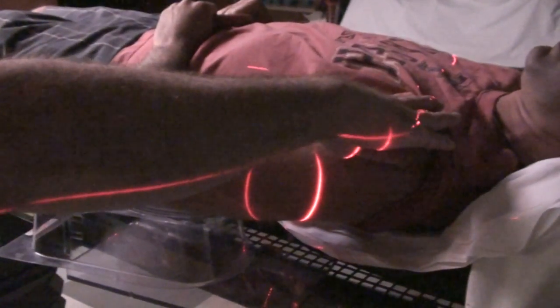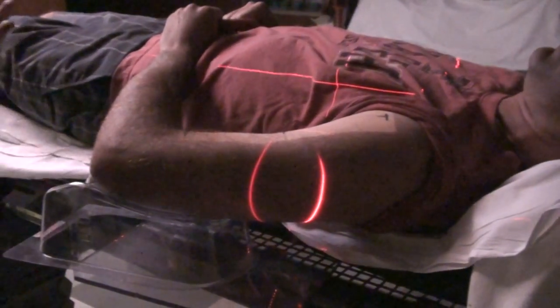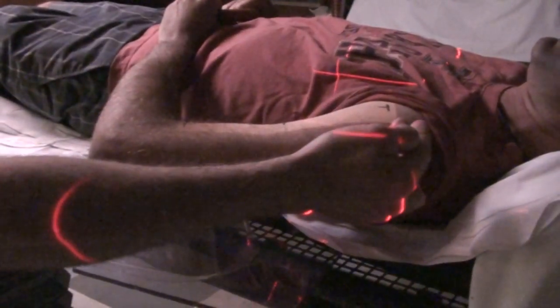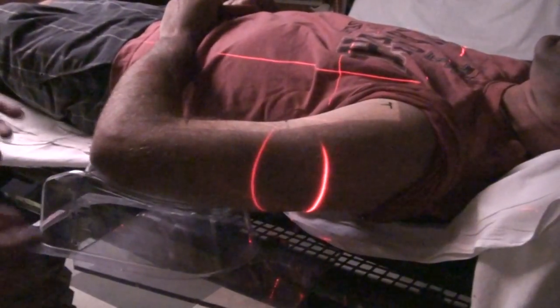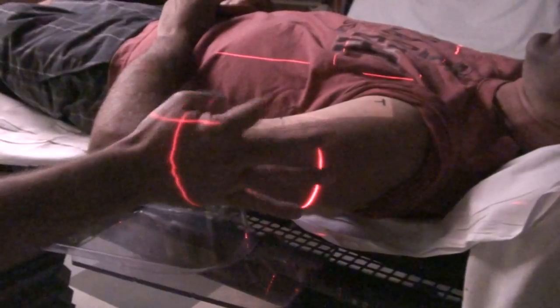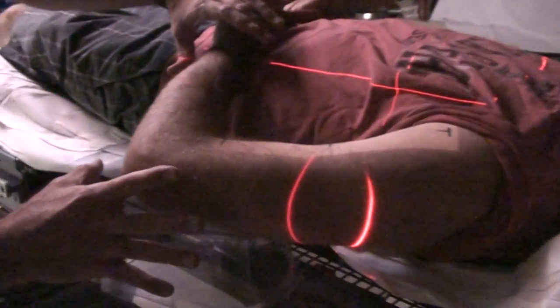Make sure that the shoulder is relaxed. A lot of times the patient will tense up as soon as you touch them, but once you stop looking at them their shoulder will relax. Sometimes these people are in pain, which makes relaxing harder. Especially if the cancer you're treating is further up — these people normally have bone mets. You've got to be very careful with any movement because this bone could be ready to break. Be very gentle.